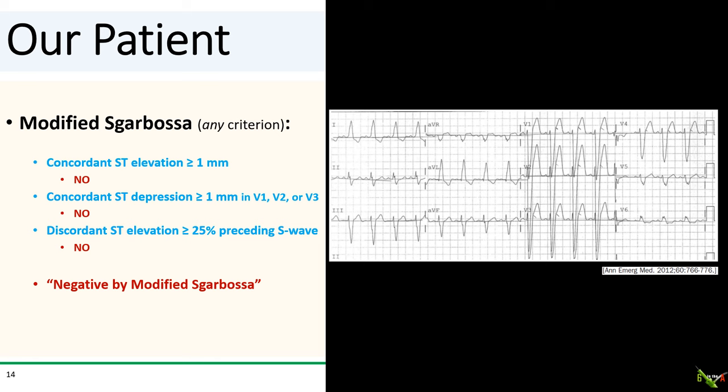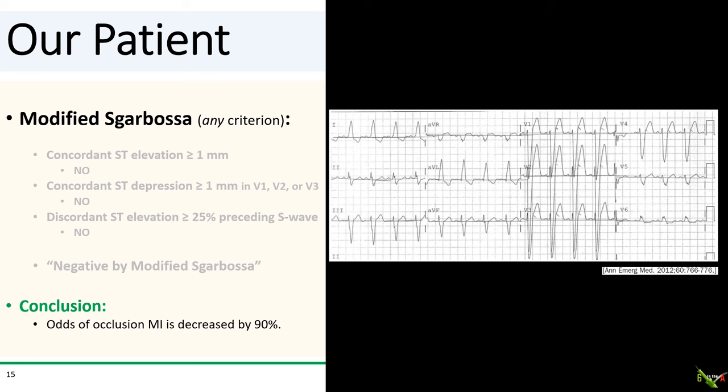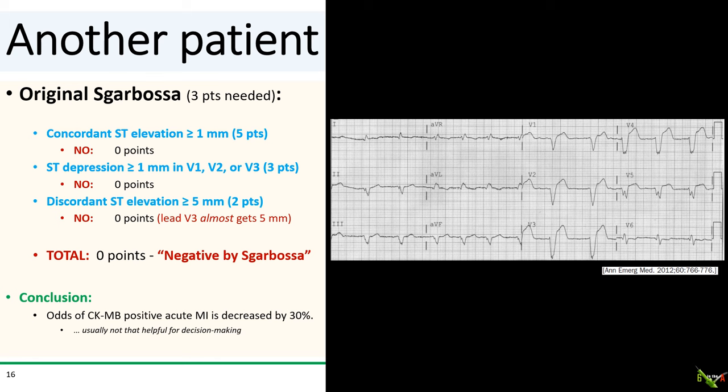Looking at the modified Sgarbossa criteria, she meets none of the criteria. Her discordant ST elevations are not 25% or more of the size of the preceding S wave. Since she is negative by the modified Sgarbossa criteria, her odds of having a STEMI equivalent occlusion MI is decreased by 90%. So you let the STEMI team spend more time at home with their families on Christmas Day, manage the patient medically, and call a general cardiology consult. The patient ultimately ruled out for MI by enzymes and was discharged for outpatient follow-up.